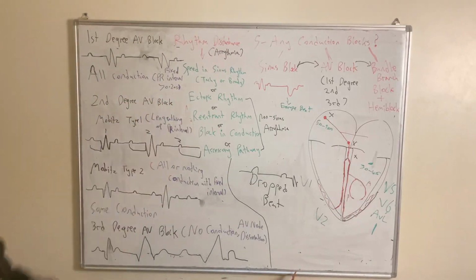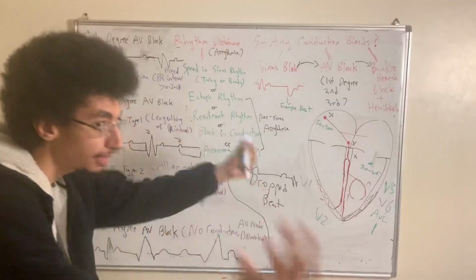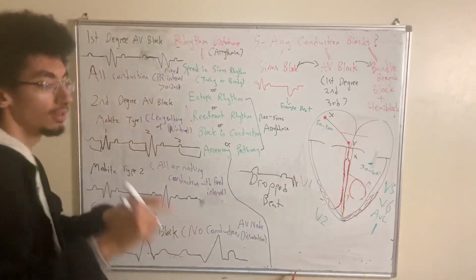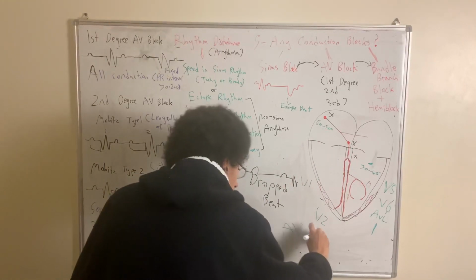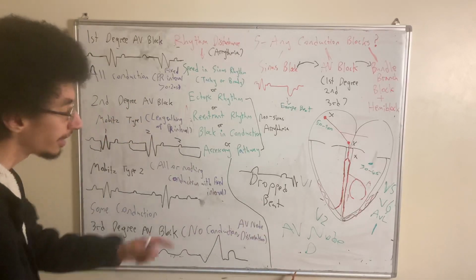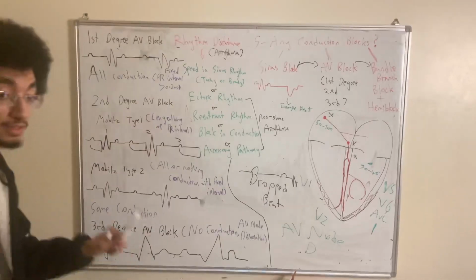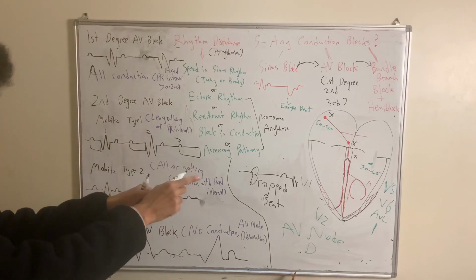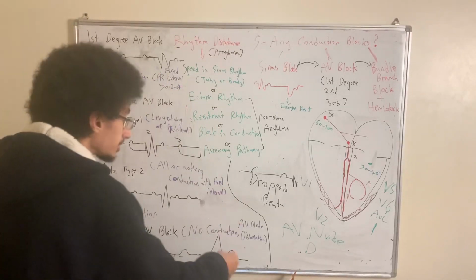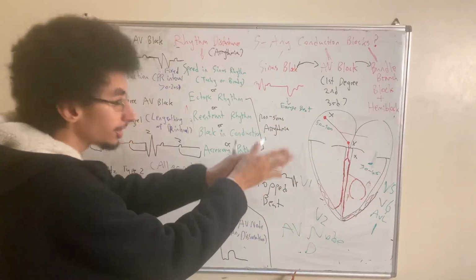What do we call this? We have a condition here. What do we call this scenario in which the atrium and the ventricles have their own pacemakers? They work independently. Each has its independent pacemaker. Ladies and gentlemen, we call this AV node dissociation. They have no relationship with one another. The P wave has no relationship with the QRS. That is the characteristic feature you will see in third degree AV block, and you might see this in certain arrhythmias, such as ventricular tachycardia, to differentiate it from AVNRT with aberrancy.